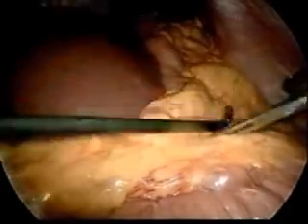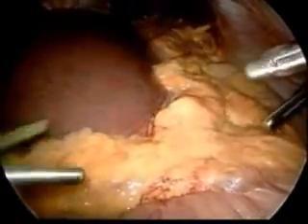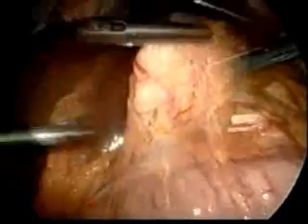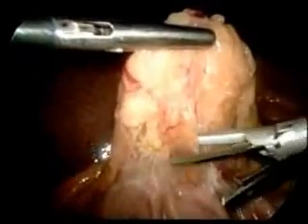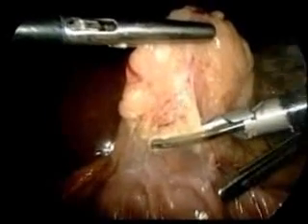After trocar insertion with port placement as shown, the omentum is moved into the upper abdomen. Adhesions are taken down. The avascular plane is exposed between the omentum and the transverse colon. A harmonic scalpel is then used to dissect the omentum free of the colon.